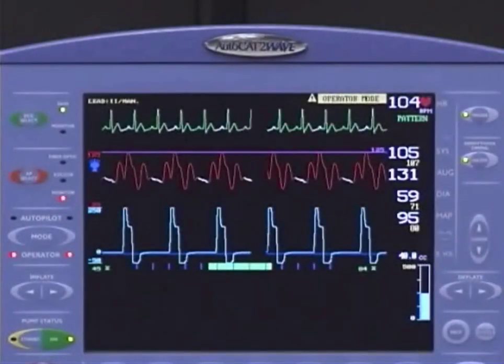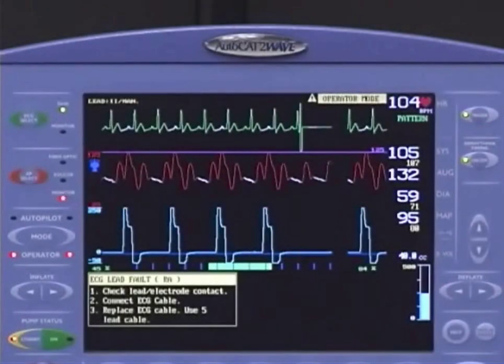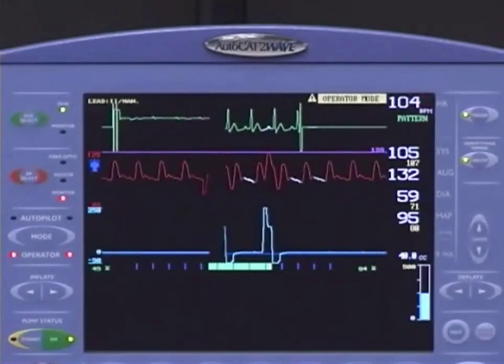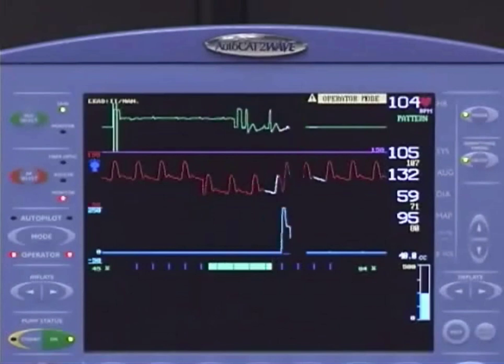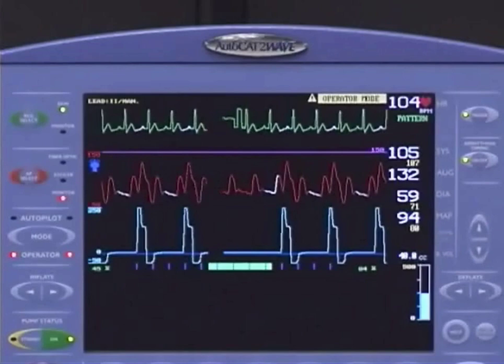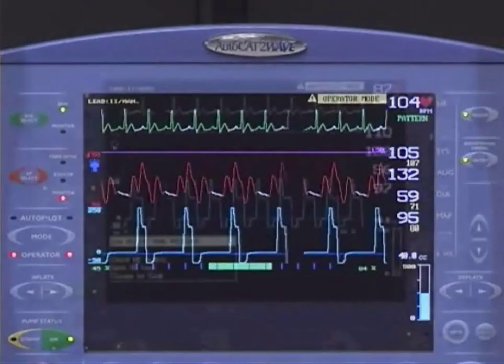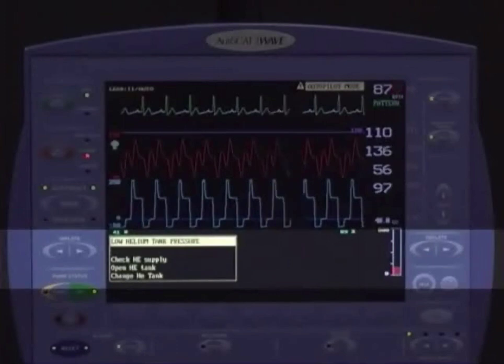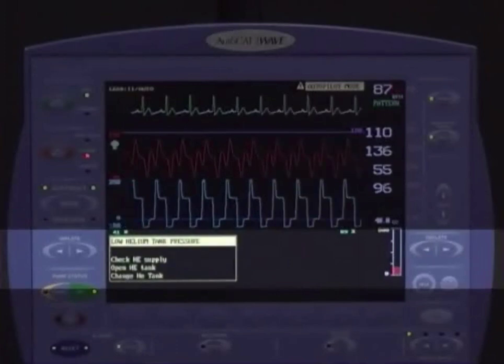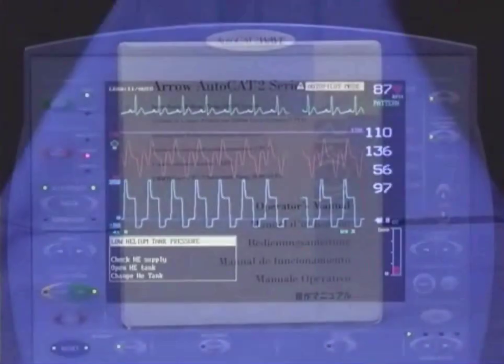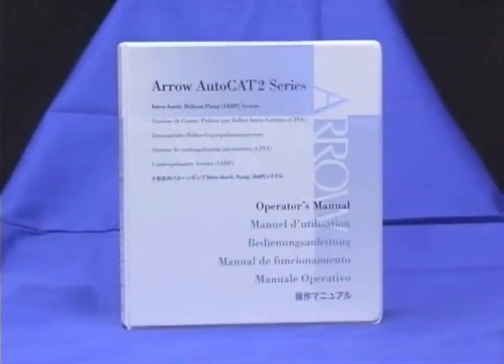The trigger loss alarms will cause the pump to go to standby, as pumping cannot occur without a trigger. As soon as an appropriate trigger is re-established, pumping will automatically resume. The other alarms and alerts do not interrupt pumping, but call your attention to actions you may need to take, such as changing the helium tank or battery status level. Refer to the operator's manual for full review of the available alerts.